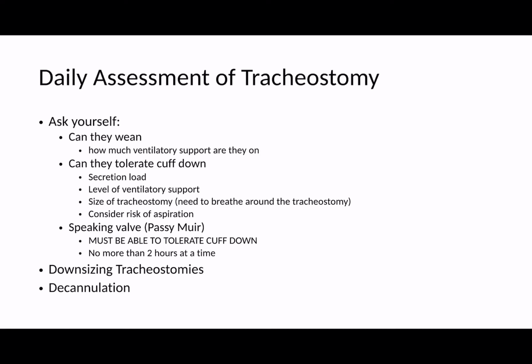Then you can think a little bit about, can they tolerate cuff down? You might hear doctors asking, can they tolerate cuff down? What they're talking about is, firstly, do they need a lot of positive pressure to be able to breathe? If you need to be positive pressure ventilated, it means you need the cuff up so that the pressure that's provided goes into the lungs as opposed to escaping through the mouth. However, if they don't need a lot of ventilatory support, they might be able to tolerate the cuff down.